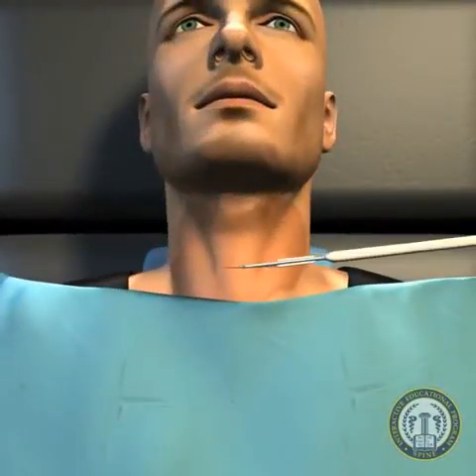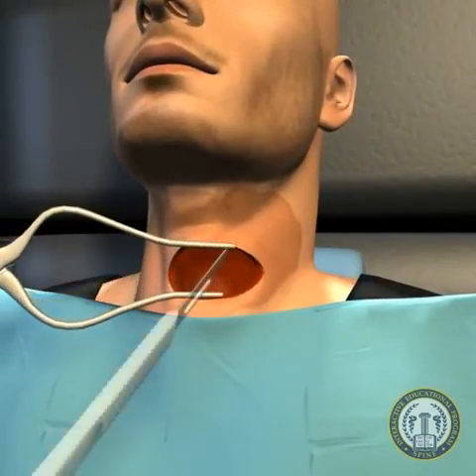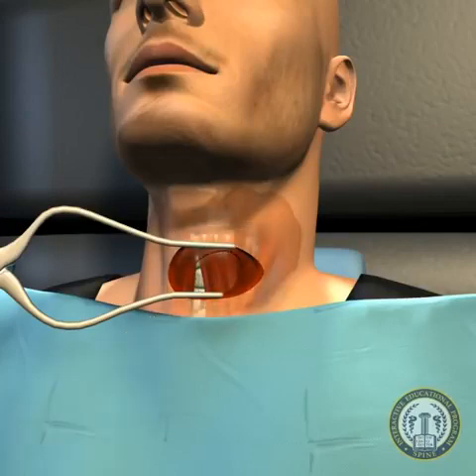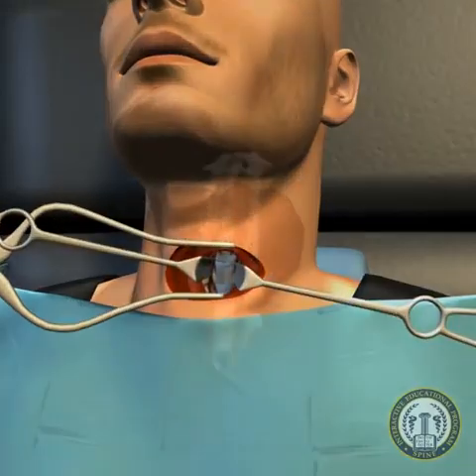The skin is incised. The subcutaneous tissue plane is developed to the platysma, and the platysma is then divided in longitudinal fashion. The interval between the sternocleidomastoid and strap muscles is developed to the anterior surface of the cervical spine.